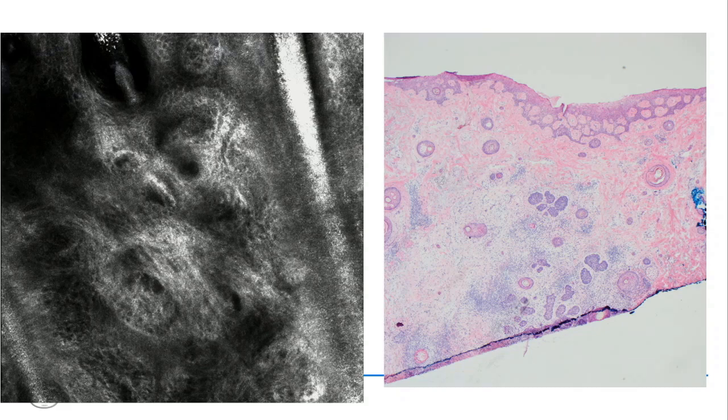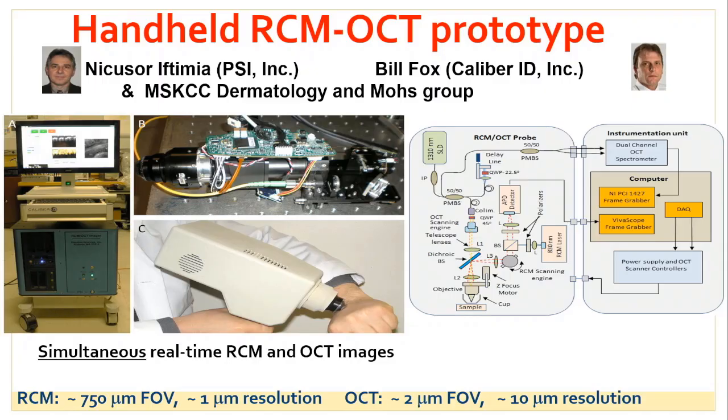There is a pitfall, obviously, to this technology, right? Which is the depth of imaging. We can only image as far as the light will take us, and we can miss deeper seated tumors, right? So that's the caveat, and we have to be mindful of such.